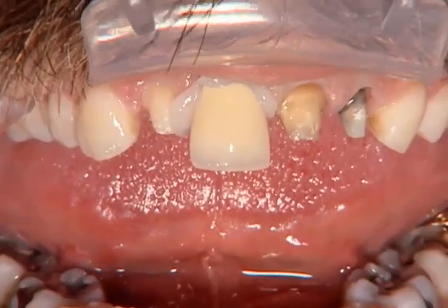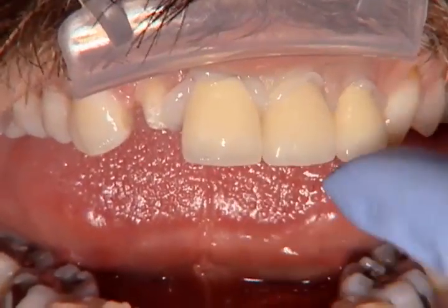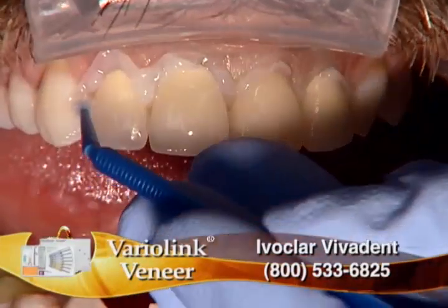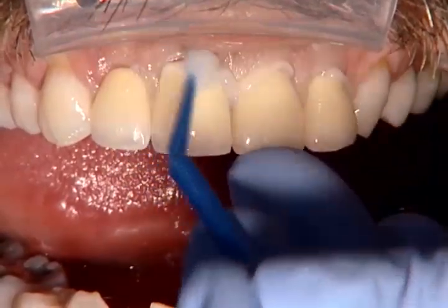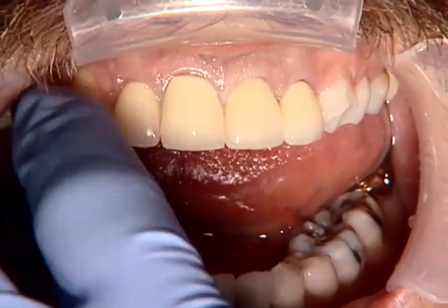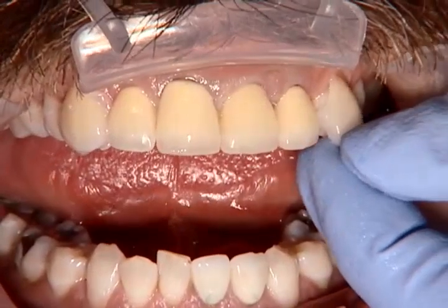If you do have shorter preparations or the crowns seem to be moving, you may wish to try in your crowns with try-in cement, as we are doing here. This is actually our veneer try-in cement, the Variolink veneer clear shade. It just helps hold the crown in place when the patient takes the mirror and takes a look at it. It holds the restorations in place so that when we take a digital picture and I look at it on my laptop, I can make some decisions about whether or not we like how the restorations look. Because of the fact that they're CZ and they have the zirconia coping, there's not going to be any show through. It doesn't matter which shade of try-in cement you use.